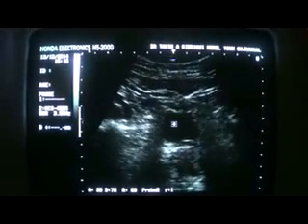This is the urinary bladder of a male patient, and here we see the prostate.